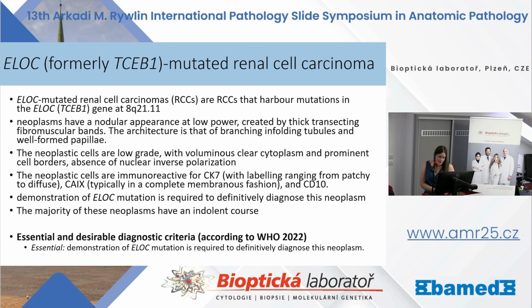The neoplasm had a nodular appearance at low power created by thick transecting fibromuscular bands. The architecture is that of branching infolding tubules and well-formed papilla. The neoplastic cells are low-grade with voluminous clear cytoplasm and prominent cell borders. In the absence of nuclear inverse polarization, very important.